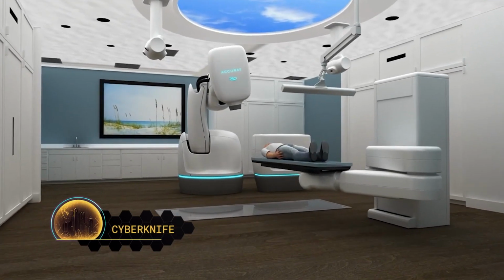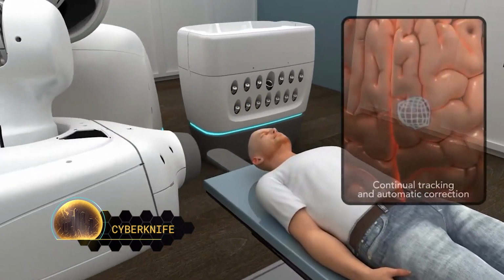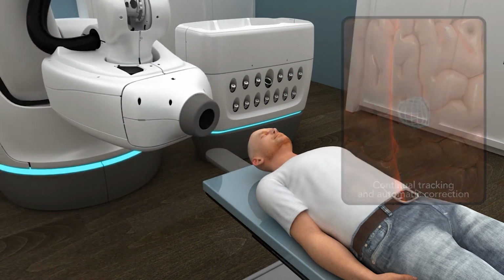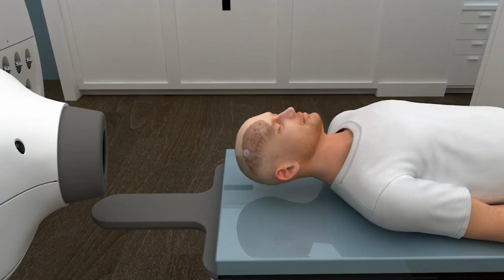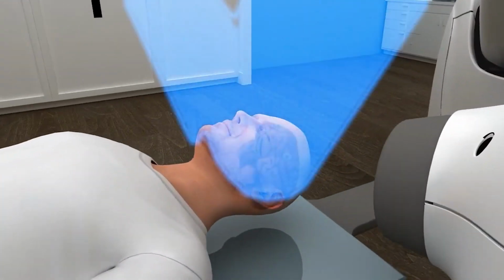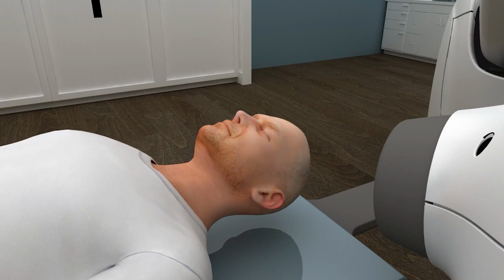Number 5. Cyberknife. The Cyberknife robotic surgery system applies radiation therapy to tumors with sub-millimeter accuracy. Invented in the 1990s, the system is currently used for treating cancer in hospitals and cancer treatment facilities across the United States. This system is not a knife per se, but a radiation source installed on a robot that enables a tailored radiotherapy beam that quickly maneuvers and adapts.